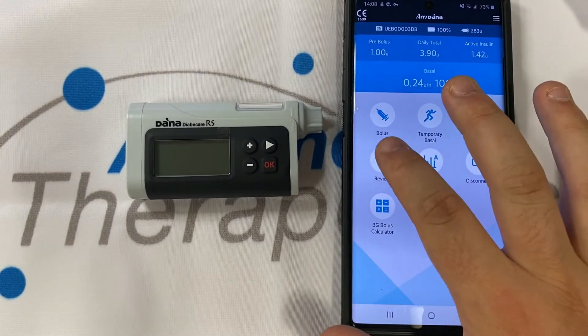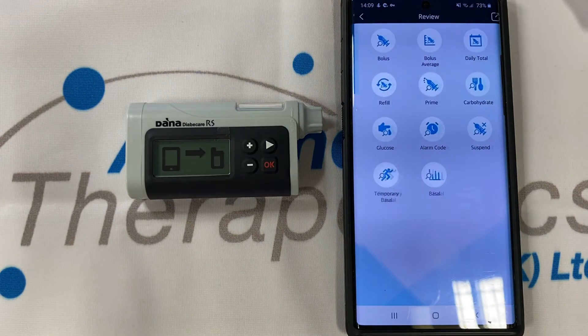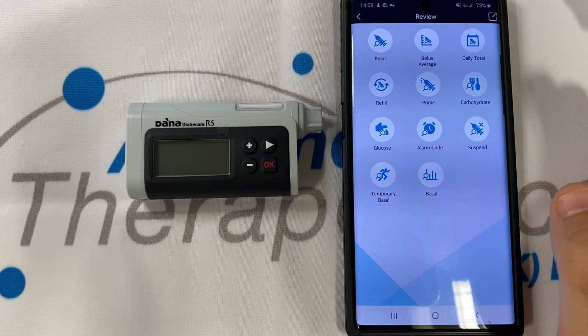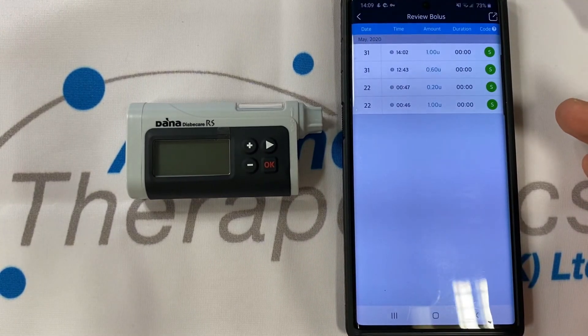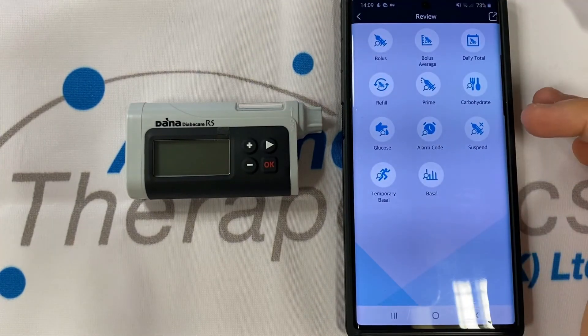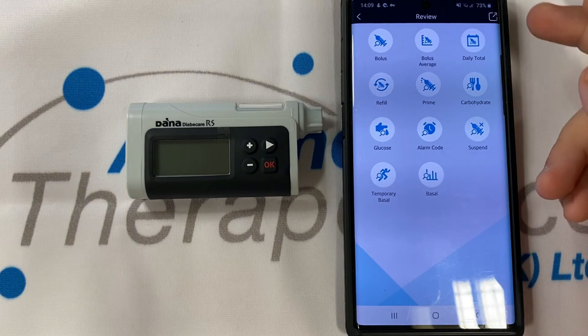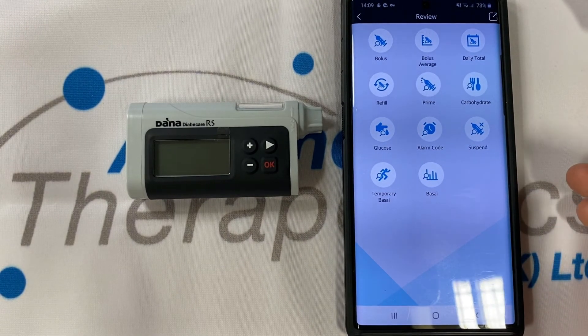The app will also give you access to your history. Tapping on review will prompt a history download. Once downloaded you'll get access to all of your history and data split up into convenient subheadings — look at your previous boluses, check out your bolus averages, any alarms that may have gone off, and ultimately use the button in the top right to share this information via CSV file over email or other messaging service.